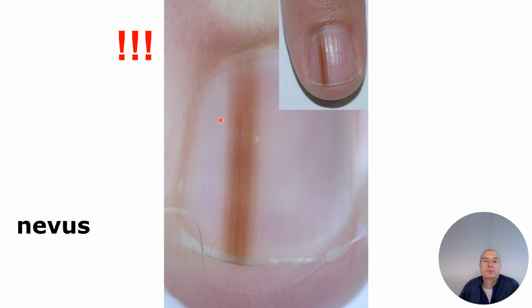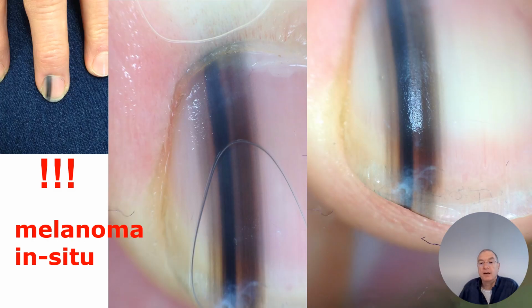So it is homogeneous, regular, a little bit of different colors, but this is absolutely correct. No way to do anything. But here's the difference: you see different types of colors. Also the size is bigger.